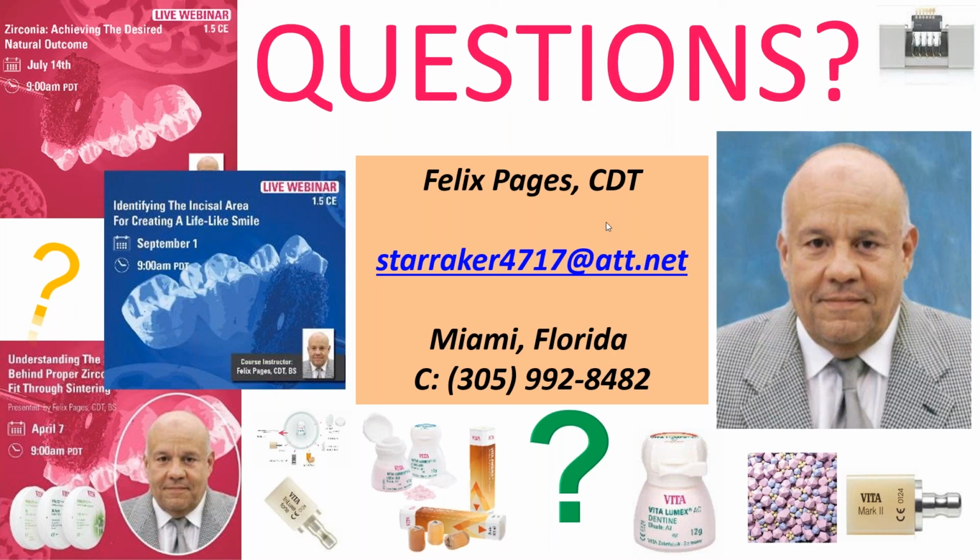So we glaze the outside, and it's okay to just polish the whole zirconia thing. On the posterior, most labs just say, well, we're just going to polish it. But that doesn't mean the color is going to be right. So a lot of times you have to do the glaze and a little coloring. I don't like to use the word stain anymore in front of patients. I always say, well, I'm going to have to go color this crown a little bit.